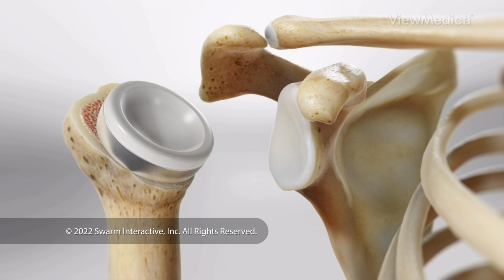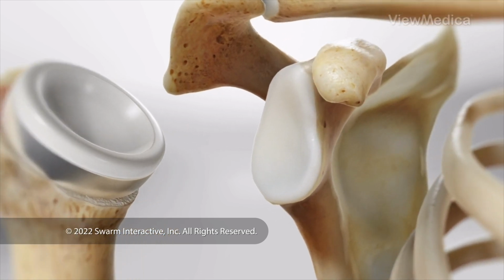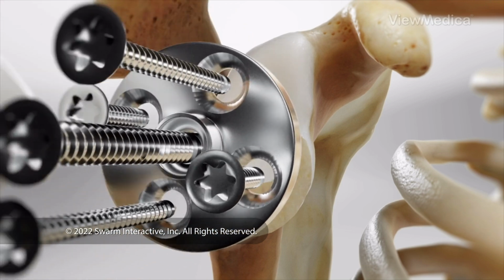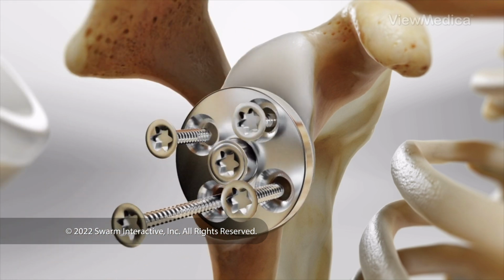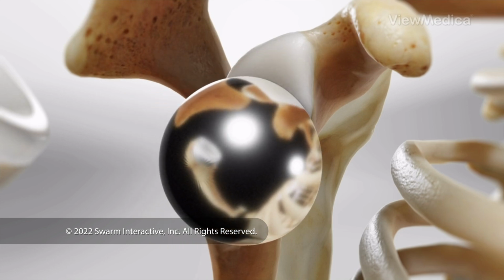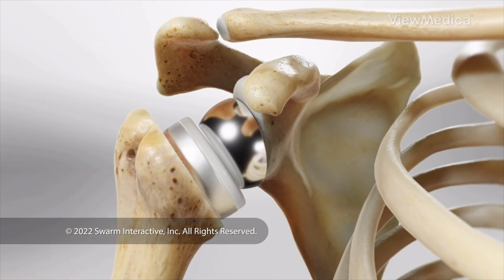Next, we modify the glenoid. That's the end of a bone called the scapula. We reshape the glenoid to make a stable surface. Then, we secure an implant to it. This is the shoulder's new ball. We bring together the new ball and socket to form the new joint.